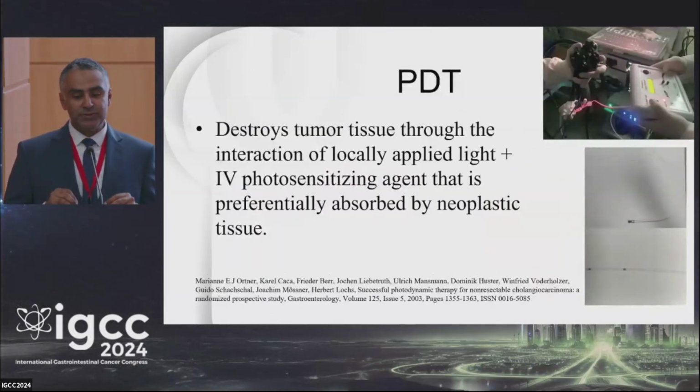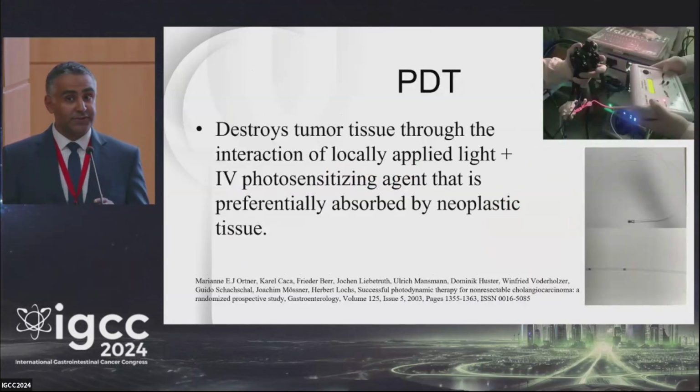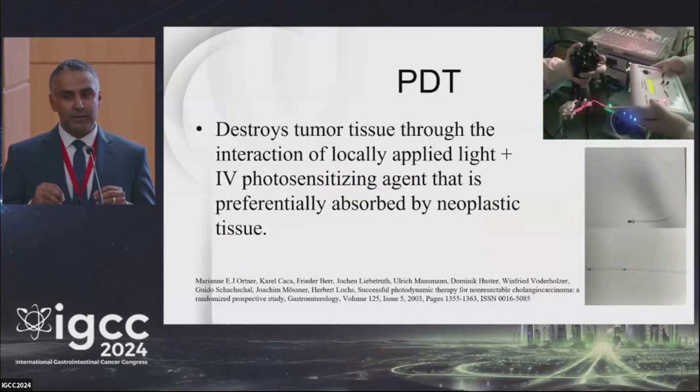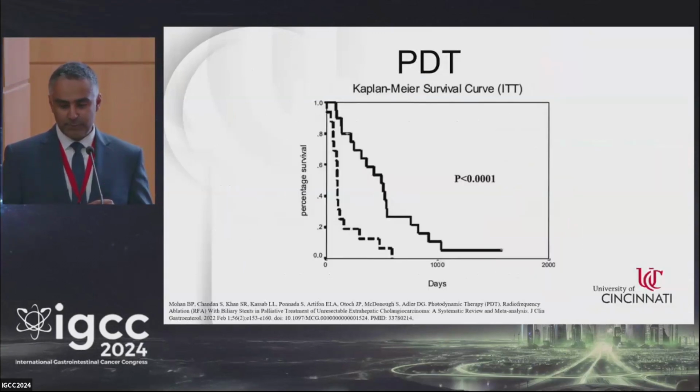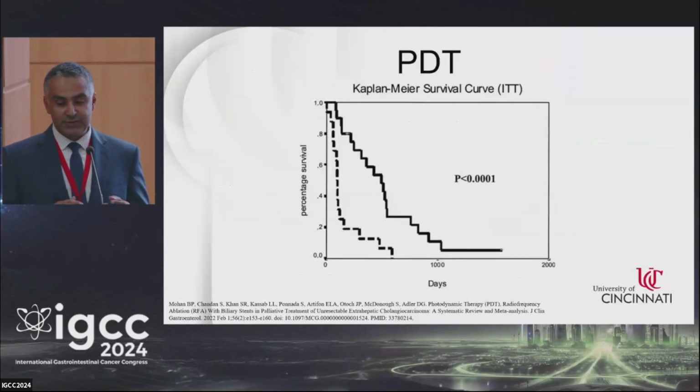PDT destroys tumor tissue through the interaction of locally applied light with an IV photosensitizing agent that's preferentially absorbed by neoplastic tissue. PDT improves survival when added to standard endoscopic management.